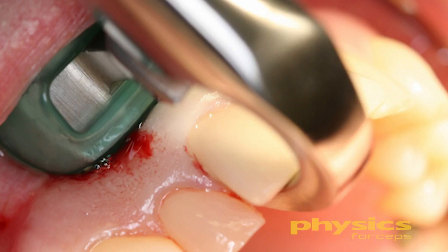What's going to happen over a period of minutes — and it may take several minutes — we have to be patient. Your muscle memory is going to tell you to squeeze the instrument and get that tooth out as quickly as you can. Don't do that. Hold the handles as far back at the edge as you can. Rotate your wrist only — no bicep, no forearm, no shoulder pressure — rotating your wrist towards the tip of the nose, placing tension onto the palatal surface of the root.